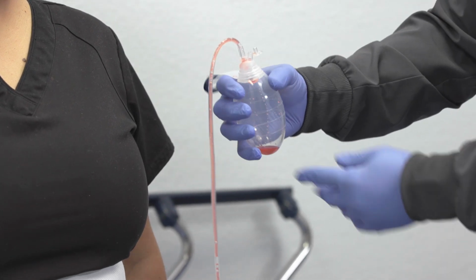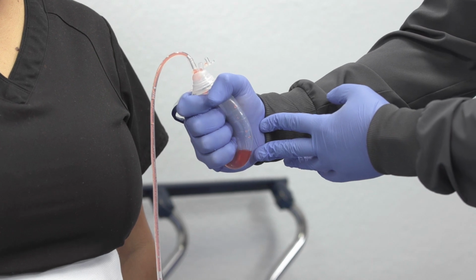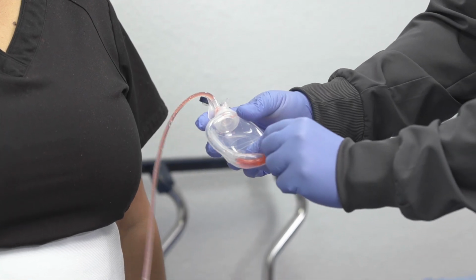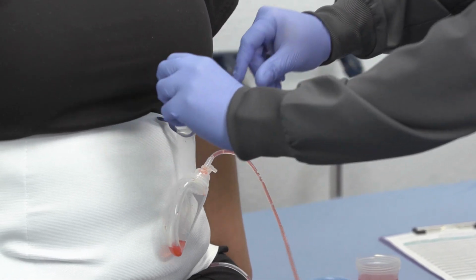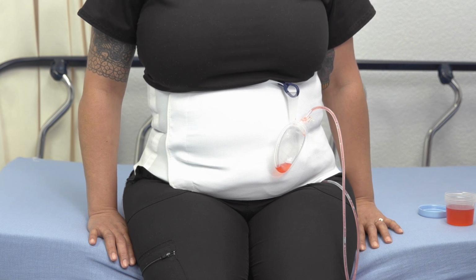Once you've drained it, you will then set the cup aside somewhere that it will not spill. You will then squeeze the bulb, compressing it as much as you can, and replace the top. And then you will let go, ensuring that the bulb remains compressed. You should notice some fluid moving through the tube. You will then clip it back to the patient. And then you will move forward to get your measurement and empty out the cup.